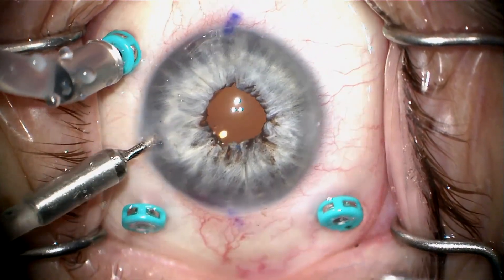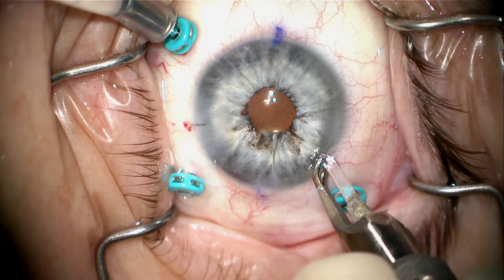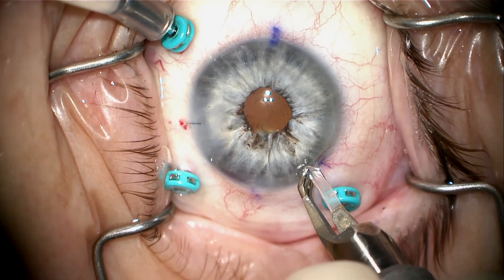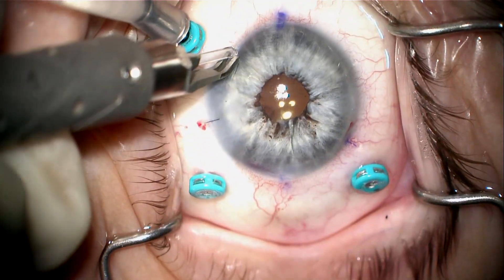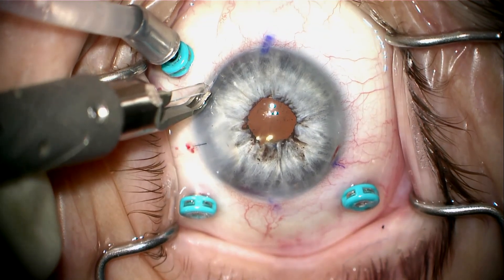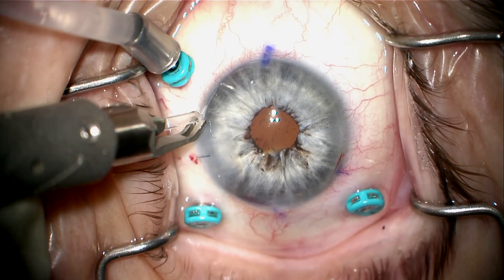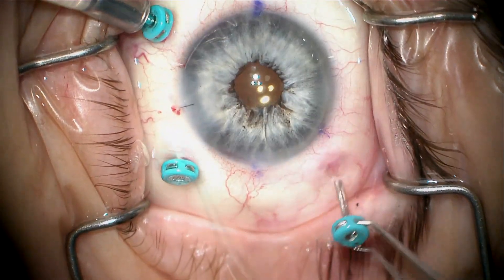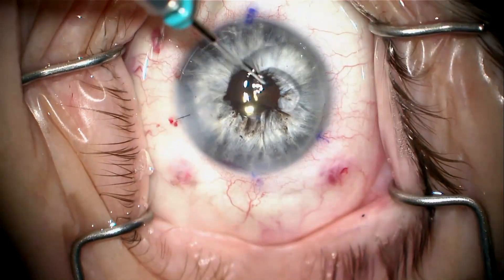We now proceed with limbal relaxing incisions. The patient had about 1.5 diopters of residual astigmatism, so the diamond blade is set based on pachymetry and we cut on the steep 60-degree axis, all planned prior to the case. We pull the trocars and the case is completed. Thank you for your attention to this case.